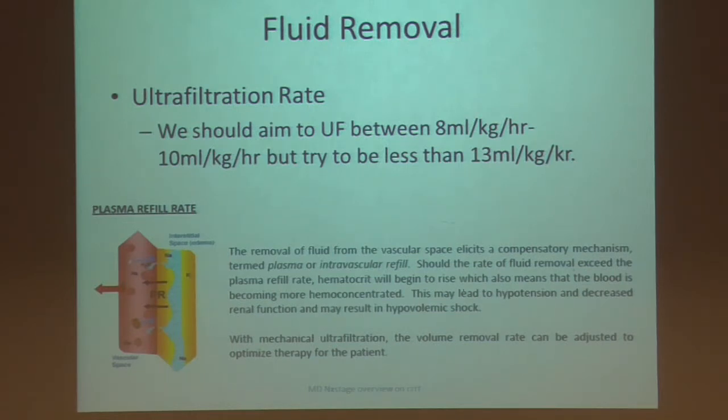So that's, I guess 70 kilo used to be the old, I just use 100 because most people are not 70 kilos. But it's between 800 to a liter of fluid that we can take off pretty safe. That's a good bit of fluid. But this accounts for everything in the hour, medications, pressors, TPN. So that's why a lot of times I like to talk with the nurses about a net UF because their hourly UF changes based on whatever they're getting ordered, or that changes hour to hour.